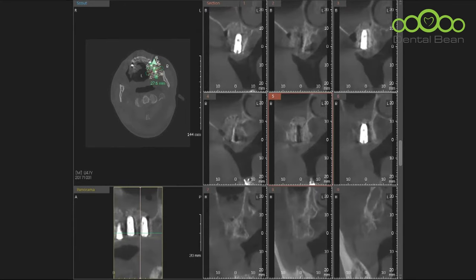Left side, I performed the lateral approach, sinus bone augmentation. Well, this picture looks not clean, but maybe several times later, less than 1 month, we can see stable bone distribution. Only a bone graft was planned originally, but it was very minor, so I just simply placed the autogenous bone chip and directly closed. It was not necessary to perform a big GBR at the site.